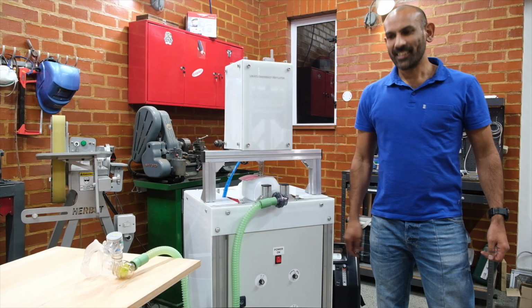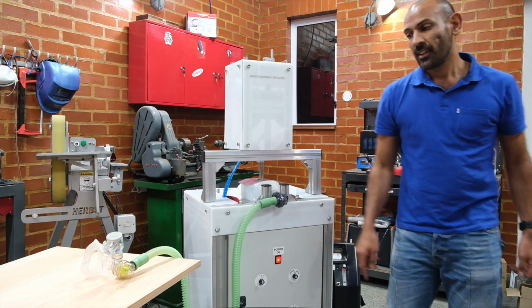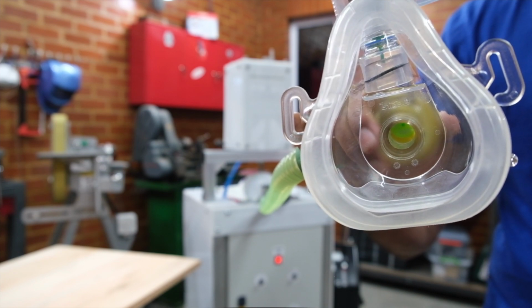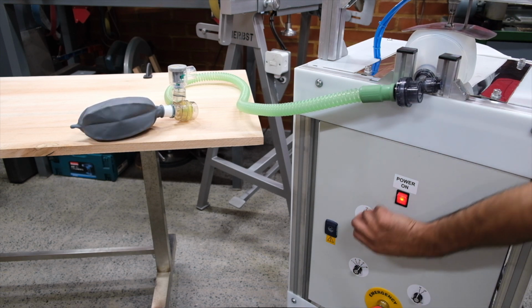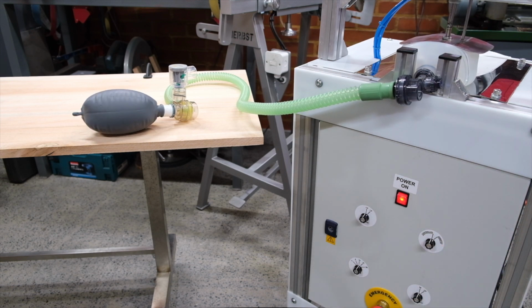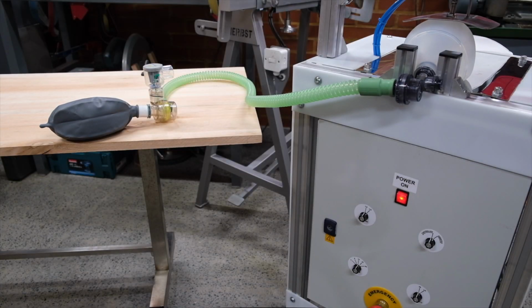Okay, let's now do a demonstration. So we switch it on. It's set on 12 breaths per minute, an I:E ratio of 1:2. And let's give that a listen. Going back to 1:2, and let's say 12 breaths per minute. Setting the tidal volume to a very low volume.